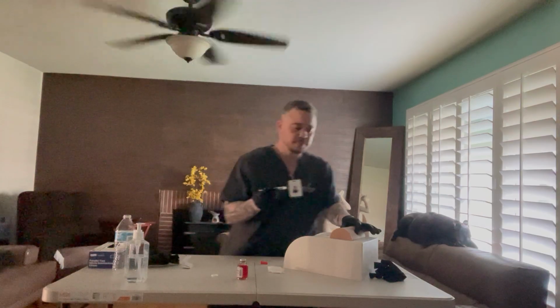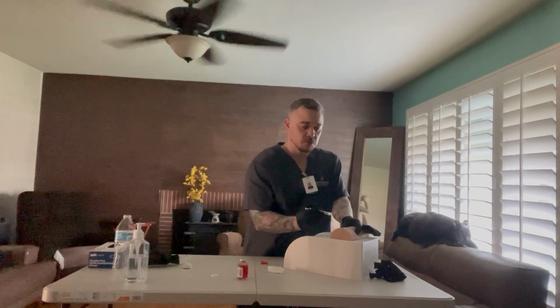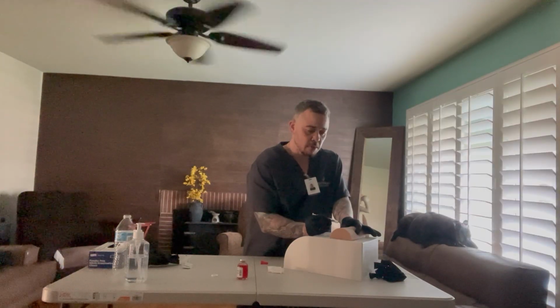Then the next thing I'm going to do is take the cap off the needle, and with my non-dominant hand, I'm going to grab the skin and pull it taut. Then I want to make sure that I go in at a 5 to 15 degree angle.